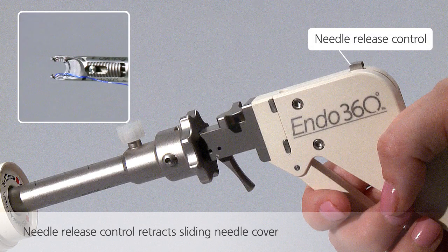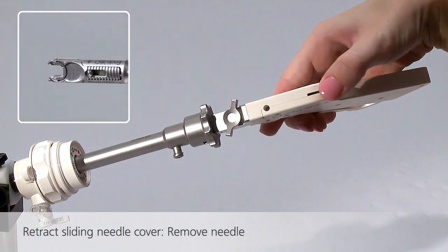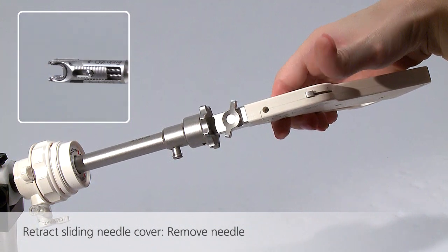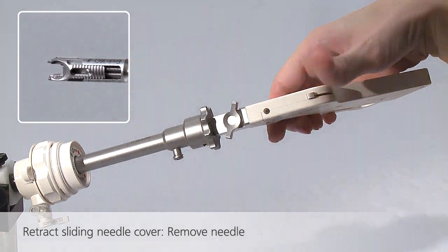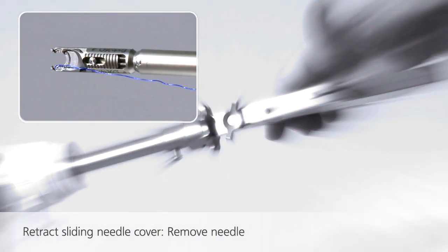The sliding needle cover can be retracted manually, or it can also be retracted using the needle release control located on the device handle. Simply pull back on the needle release control to retract the sliding needle cover, enabling the needle to be safely removed from the device.